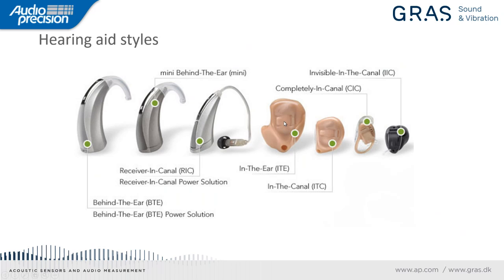Next over, we have the in the ear. This is somewhat like an in-ear monitor that musicians use. So you have, in this case, the microphones on the outside and the sound conduction on the inside. There's a larger one shown here on the left.